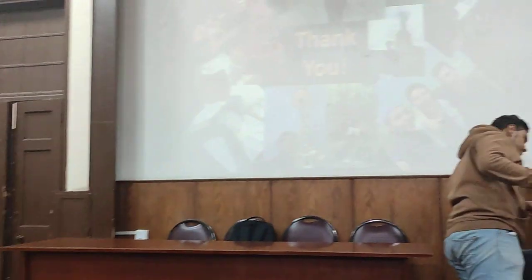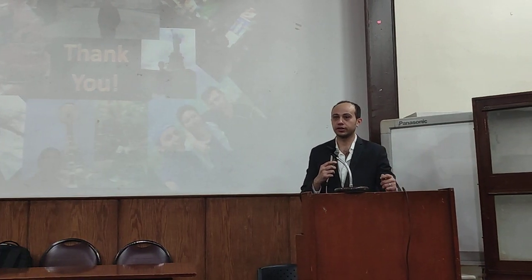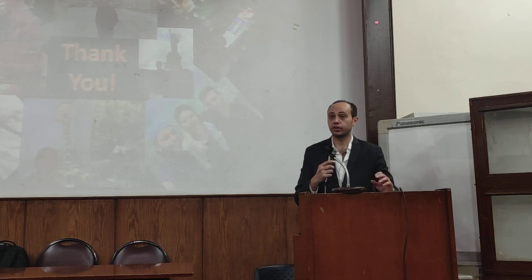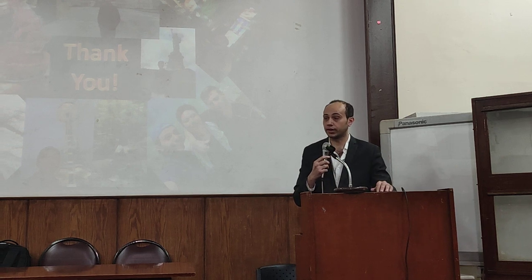Definitely, yeah. So we wanted to look at the large choroidal vessels to see if the changes are replicated. However, the spectral domain machine doesn't give you good enough pictures, and so if we attempted to get pictures using the spectral domain, the pixel intensity, the numbers that you're going to get are not going to be real. We need a swept source machine that is good enough to give you a very clear, crisp picture of the large choroidal vessels, so you're able to analyze the pixels with clarity.